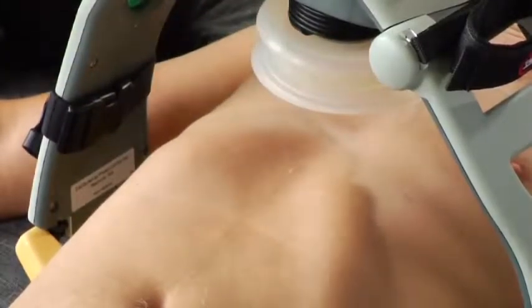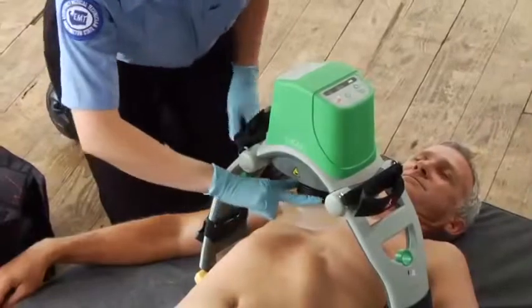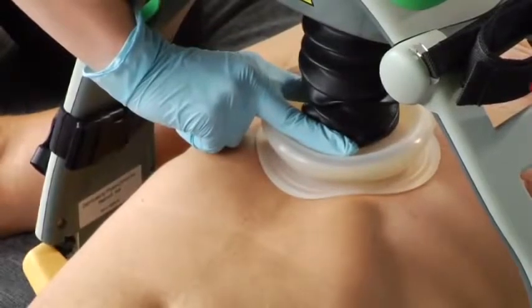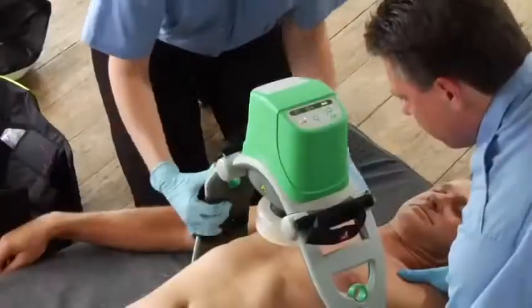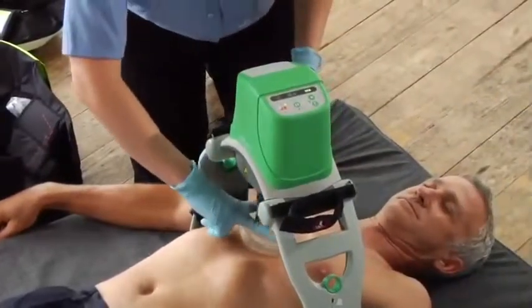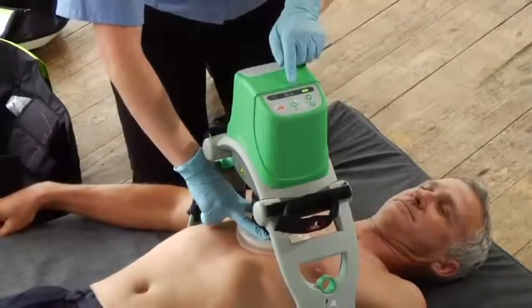You should be in adjust mode — you can tell by the LED. Use two fingers to lower the suction cup. You want the pressure pad inside the cup to touch the patient's chest but without compressing the chest, so it doesn't compromise circulation. If the edge of the cup is below the edge of the sternum, you'll have to reposition — lift it back up and move Lucas by pulling on the support legs. Push the suction cup back down. Hold it there and push the pause button to set the upper limit of compression. It's important to press the pause button before removing your hand from the suction cup. When Lucas is operating, your fingers should not be on or below the suction cup.